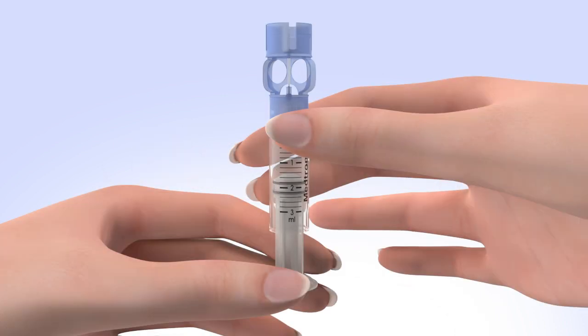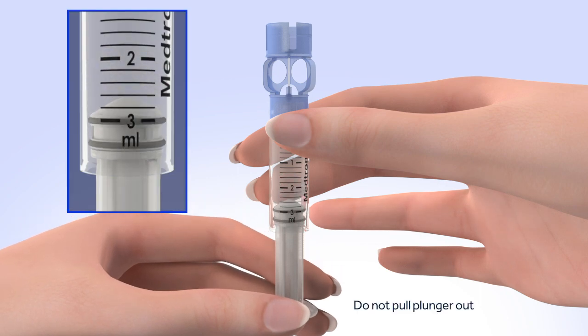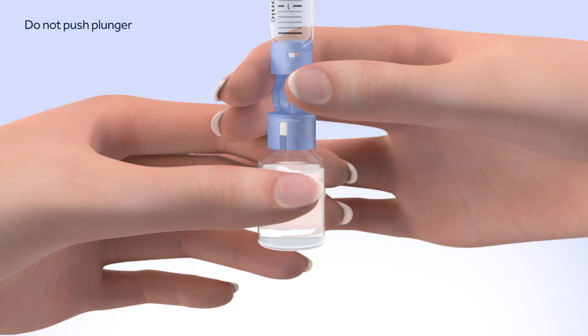Pull the plunger so the top o-ring is positioned at the amount of insulin you plan to put into the reservoir. Be careful not to pull the plunger completely out. Hold the reservoir by the blue transfer guard and connect it to the insulin vial by pressing down. Do not push down on the plunger during this step.